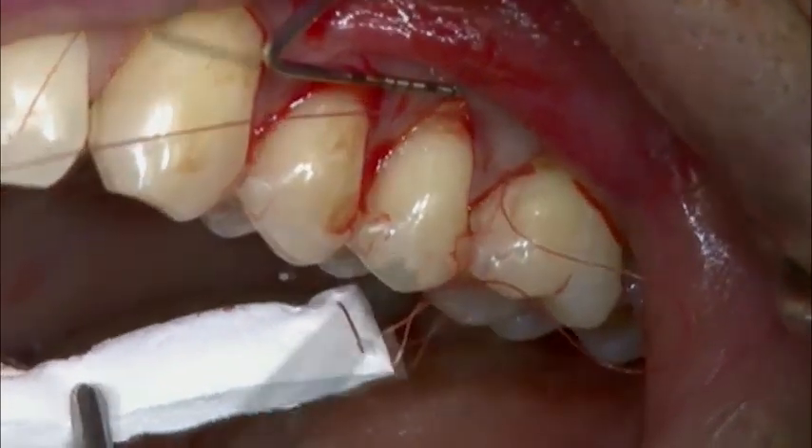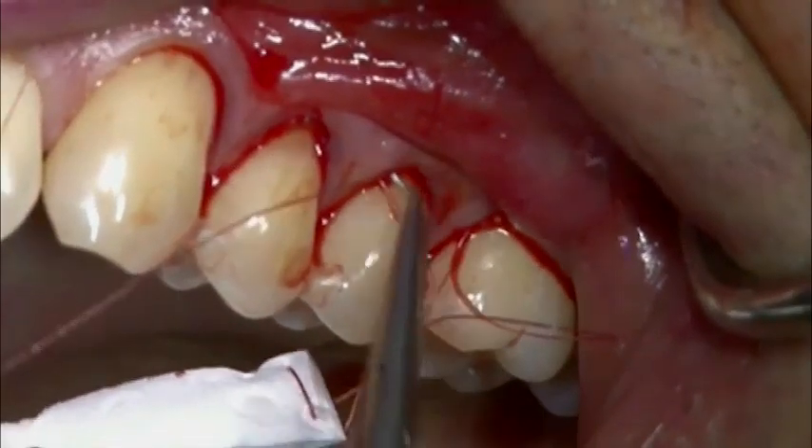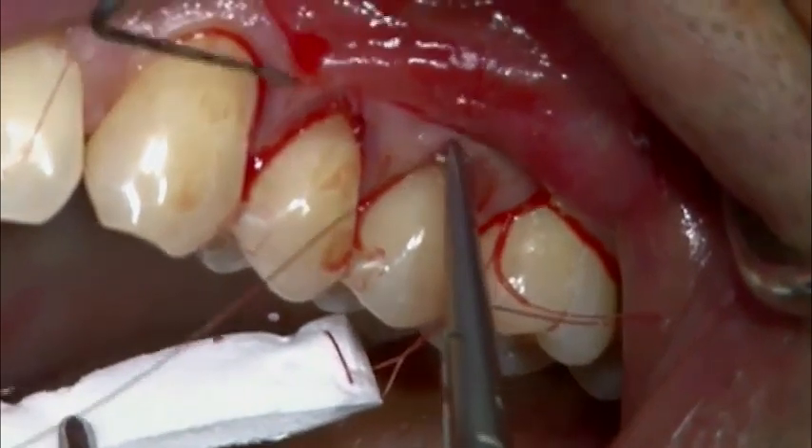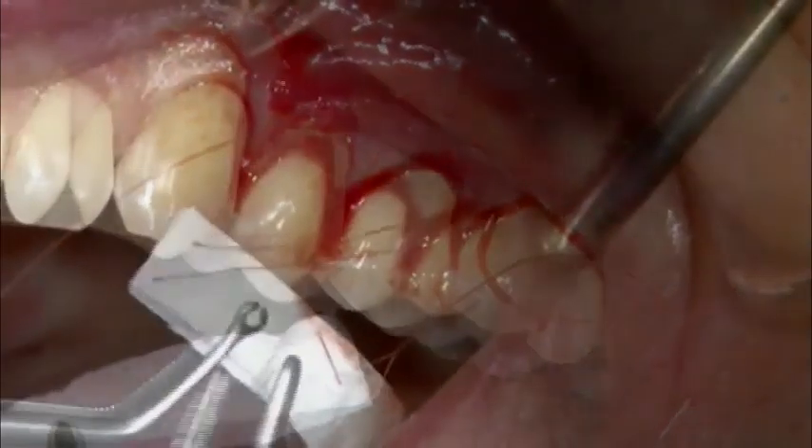The needle passes through the tunnel, behind each papilla, back to tooth 2-4. The suture exits at the same level of the first stitch on the mesial aspect of the tunnel, but more apically.